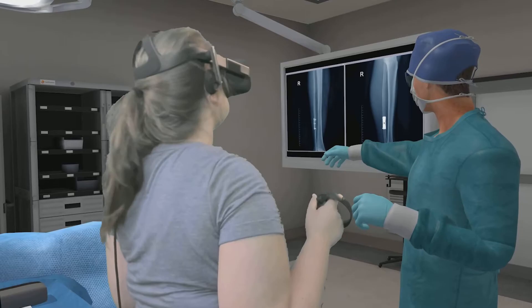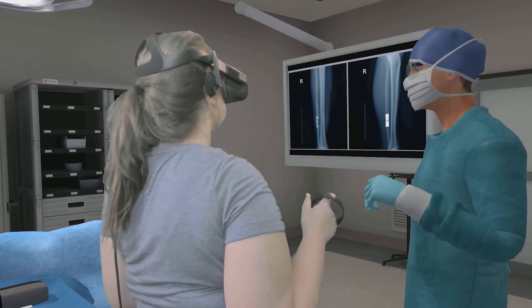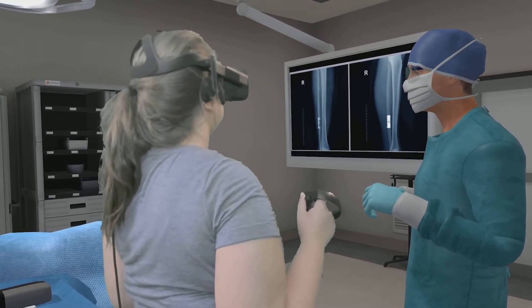The x-rays from your surgical deductions should look like these x-rays. We should clean up and consult with the family — I'm sure they're anxious to hear how the surgery went. That was a very successful operation. Nicely done.